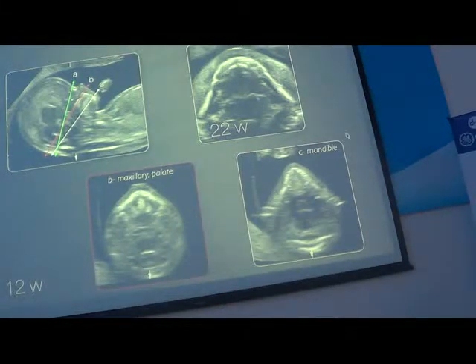round. Ở phía trên đây là hình ảnh xương hàm dưới vào thời điểm 22 tuần, nó trông rất khác so với xương hàm dưới vào thời điểm 12 tuần. Các bạn thấy nó cong tròn hơn.